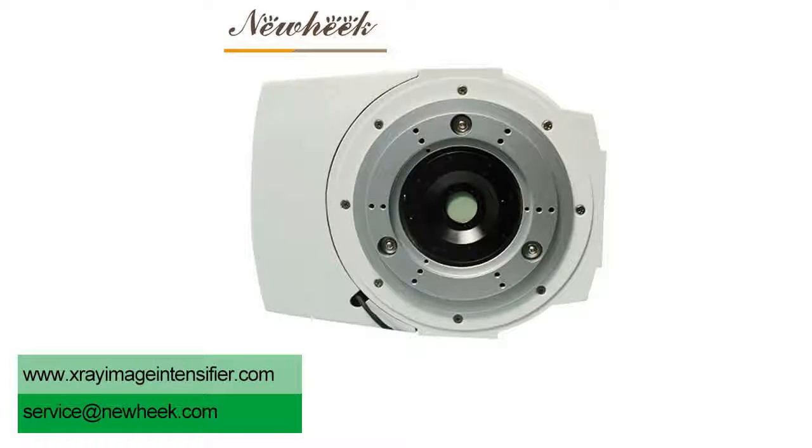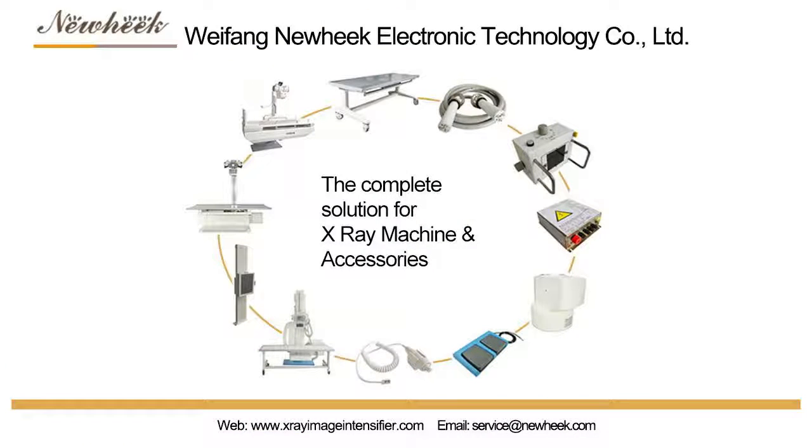If you are interested in our Image Intensifier TV system, please feel free to contact us.